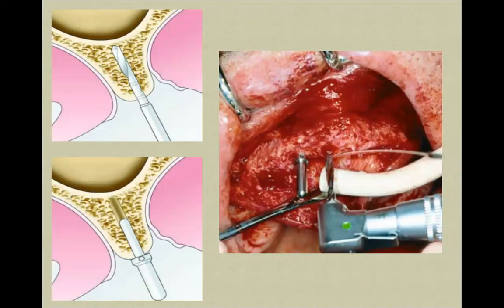The only aim is this: the implant should be placed inside the bone as parallel as possible, unless you are using the all-on-4 concept. But this is something advanced. We will not discuss this today.